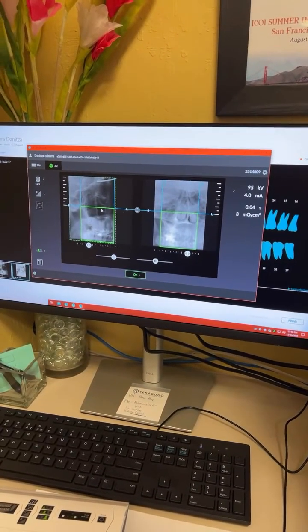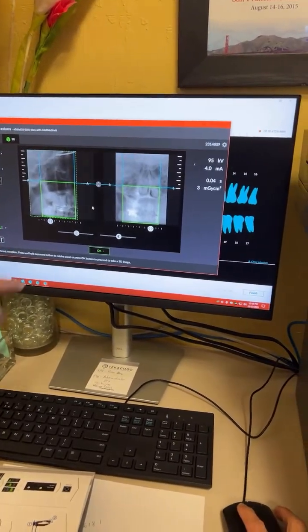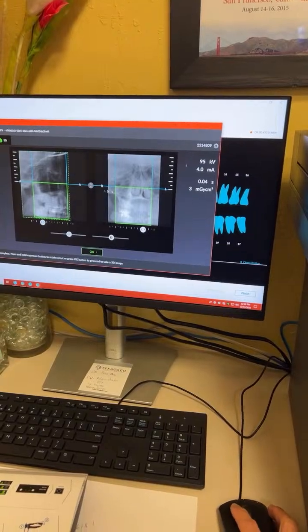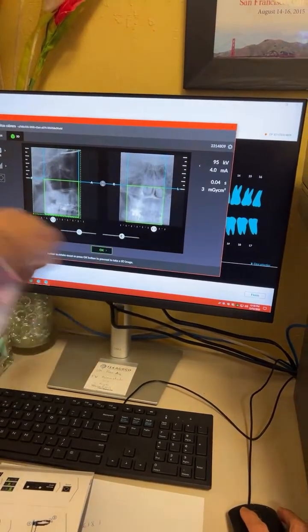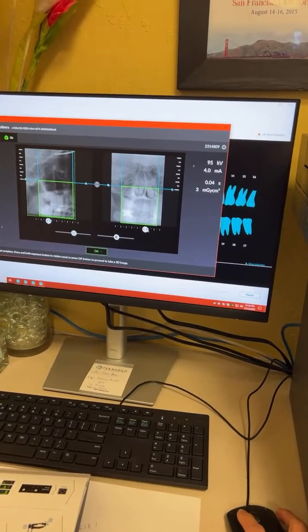But you're working in the maxilla. No, I just want something right there. I don't need too high. Then that's the smallest you're going to get right there. That's a 5x5. Okay, and you can center it left to right if you want to move that, or the other way. Or you can go up.